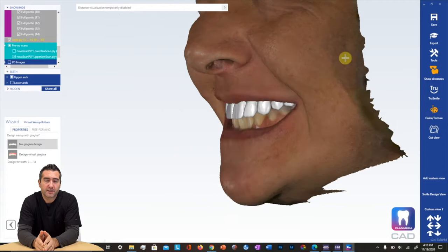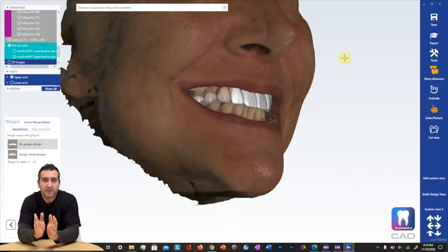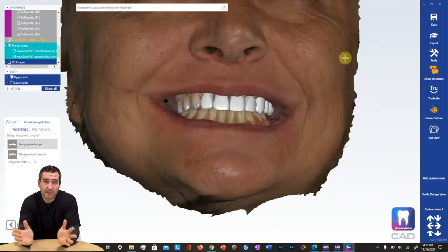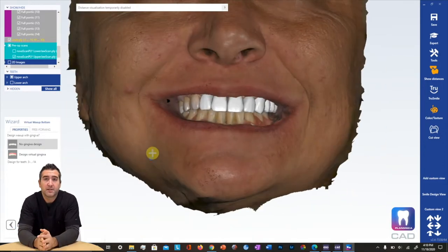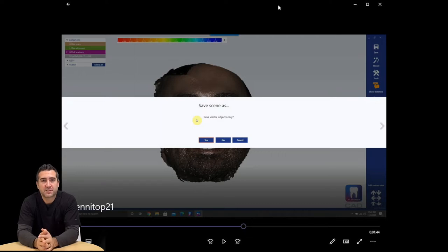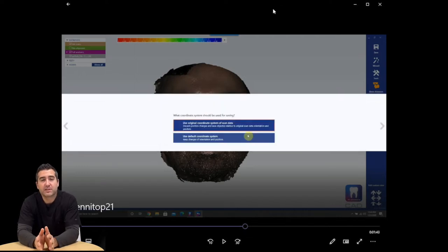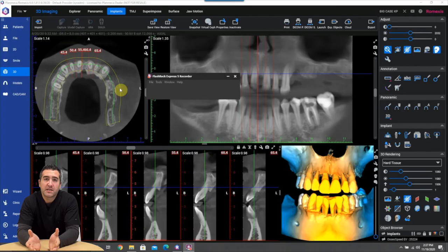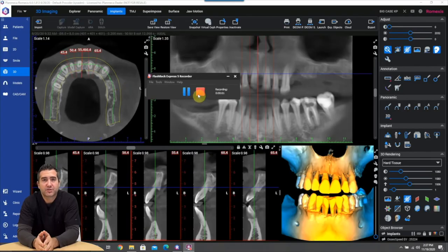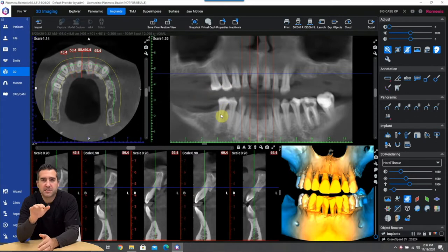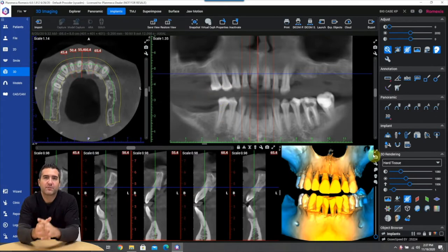You're looking at the inter-pupillary airline, the midline, the facial aesthetics, the lip line, lip at rest, facial thirds. Everything's taken into consideration with this wax up and then what's really cool, it being an open system, is you just right click and hit export scene and you can save it as an STL but make sure you select use default orientation so everything's kind of pinned together.